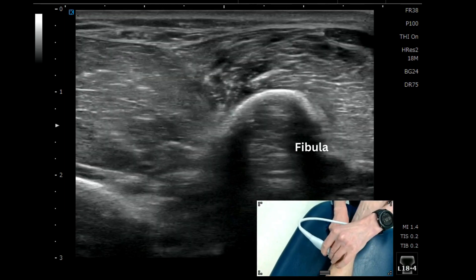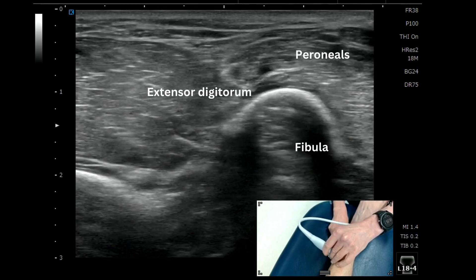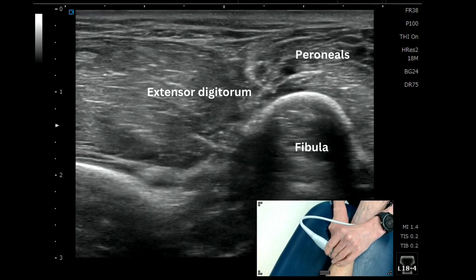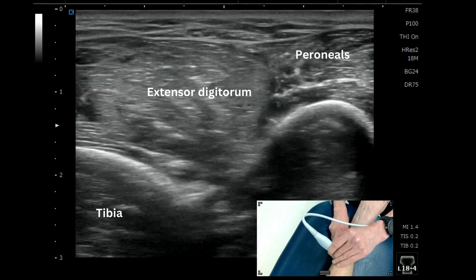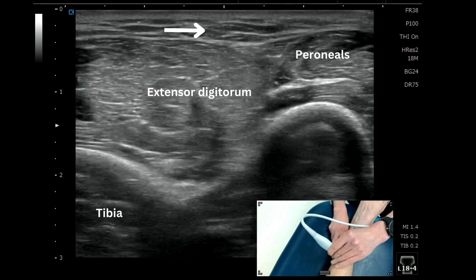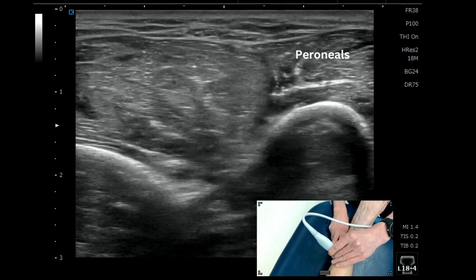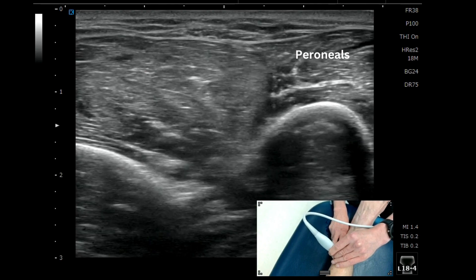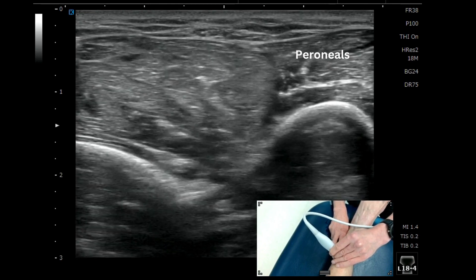Then you put your probe just above your fingers and you're over the lateral compartment. The peroneal musculature is lateral and the extensor digitorum is more medial. If you look carefully in this image, you can see that the peroneal nerve is actually superficial to the extensor compartment.